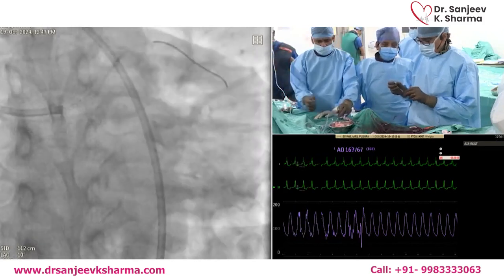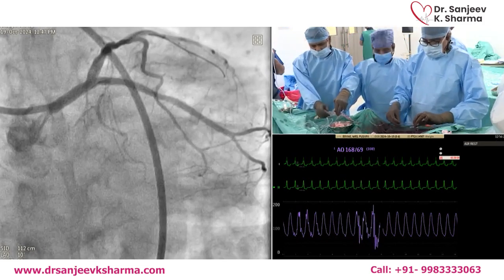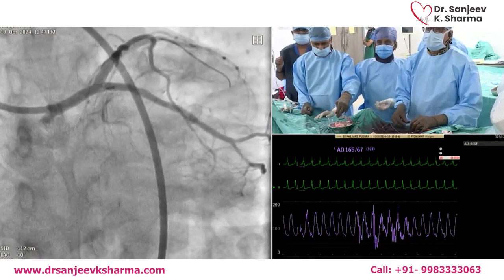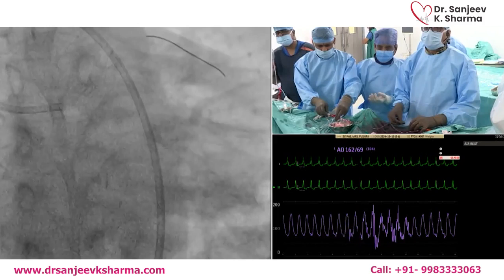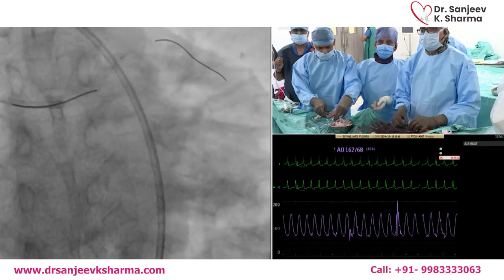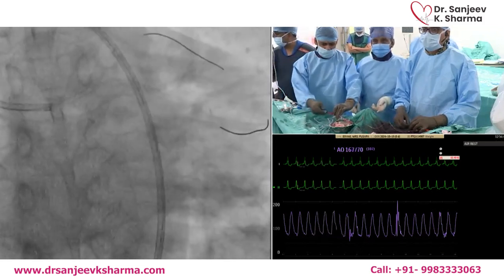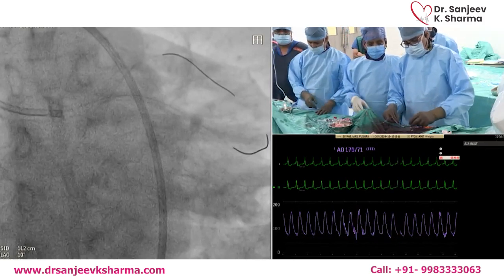Yeah. What we do is we are going to cross now, and then we'll have a 4.0 high pressure, and then 4.5 actually. Left main was 4.5. Yes, so we are going to first recross the circ, and go high pressure into the circumflex to open it up. Yeah, good. And then do a kiss, and then ultimately the POT.